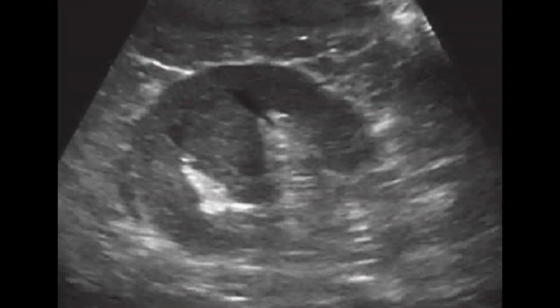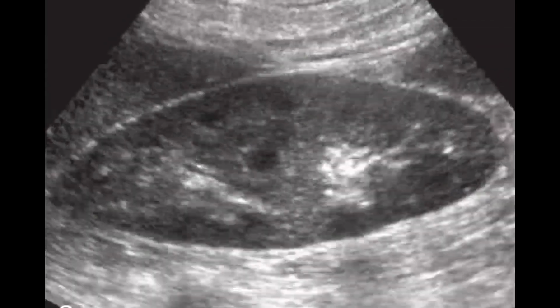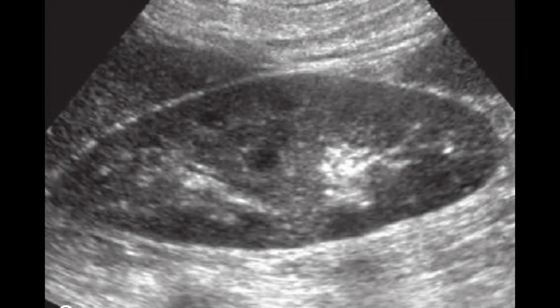Here is a transverse section, and on the transverse image you can appreciate that it will mimic a mass like that. Here you can clearly see that the column of Bertin is in continuation with the renal cortex, and this explains that this is not a tumor, this is the real column of Bertin. This is the one thing where most clinicians misdiagnose and mislabel the column of Bertin as a tumor. Another view is here, another picture just for clarification, to take these home points and to clarify your mind that whenever you come across a column of Bertin, you should not confuse it and should not mislabel that case.